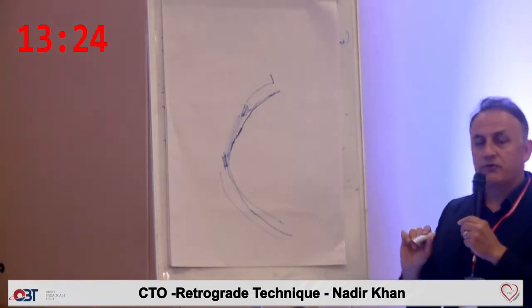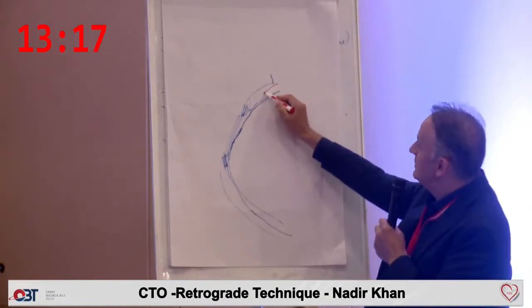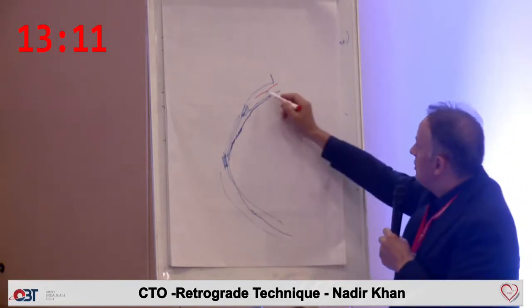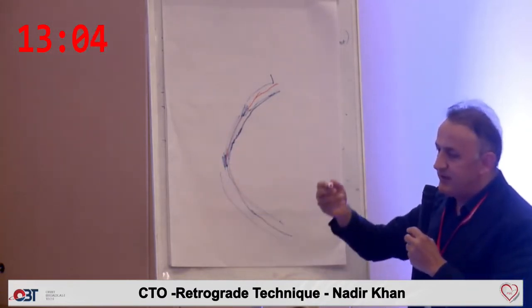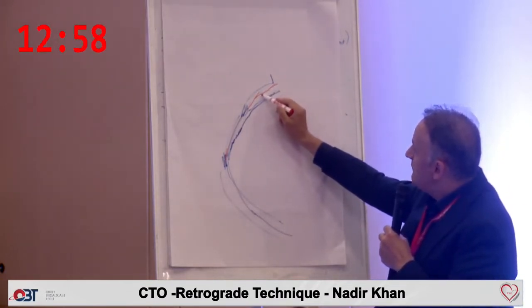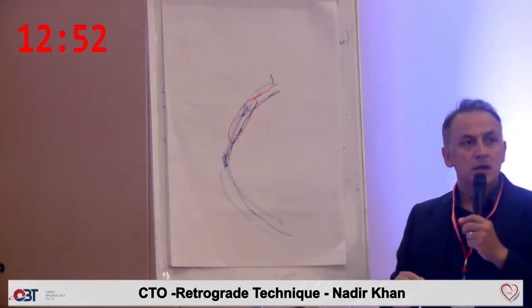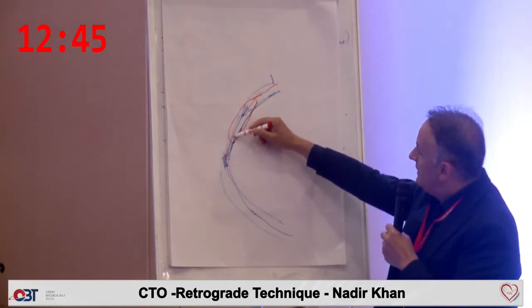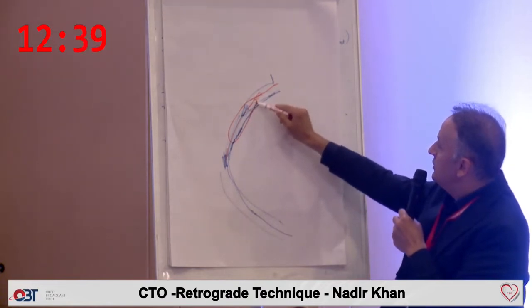This is the logic of reverse CART. We send a wire from the proximal side. We don't care that much whether it is intraluminal or subintimal. We send a wire to the distal up to here. Of course, if it crossed the lumen, that's fine, but that's not the case. Most of the time it is stuck somewhere. Over this wire we do ballooning here, all right? We have a space here with the balloon. It could be intraluminal or subintimal. After ballooning, this space will have direct contact with the lumen. That's the key: this balloon is in contact with the true lumen.